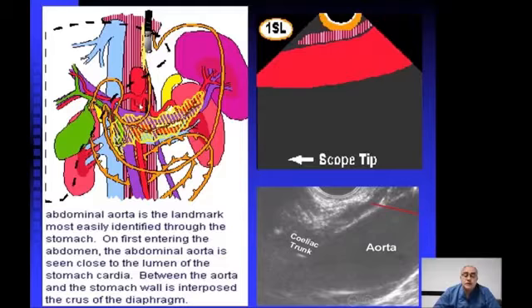The first one is the celiac axis. We can see clearly the celiac axis, where celiac plexus neurolysis and block can be done. And we can see also the branches and the seagull of the celiac axis, which is the left gastric and the splenic going to the left, and the common hepatic.